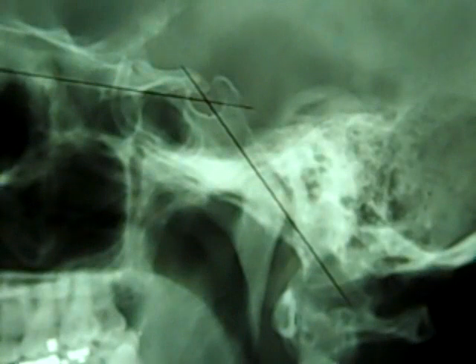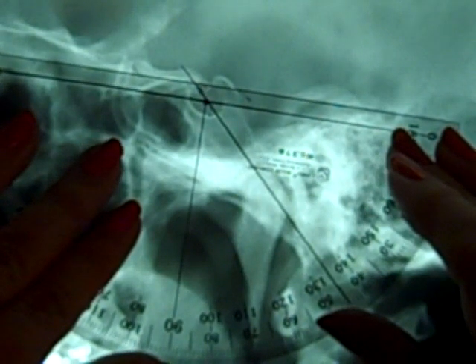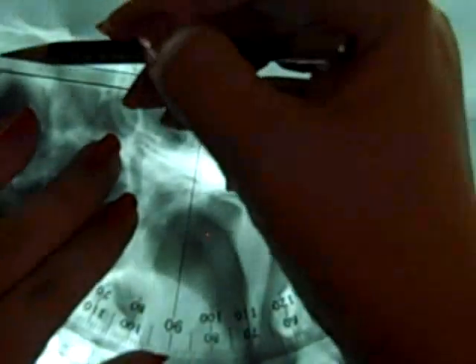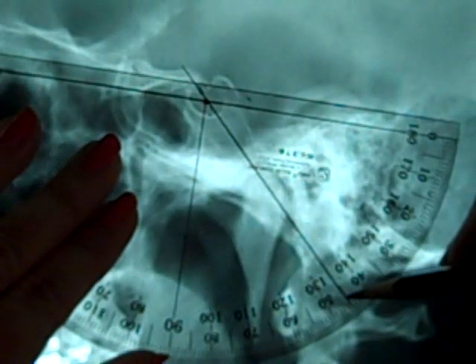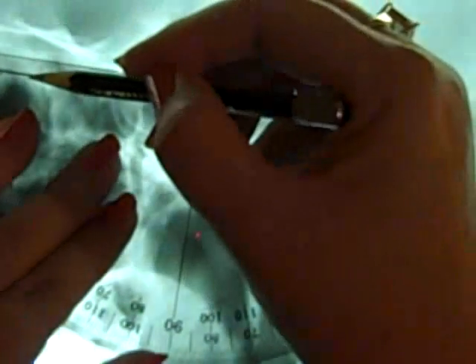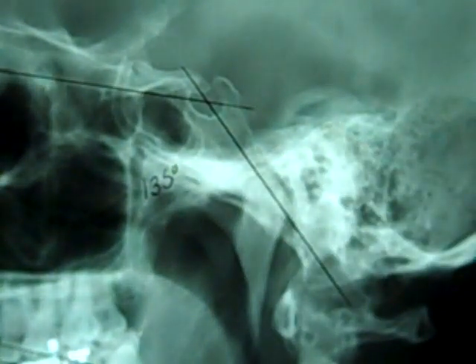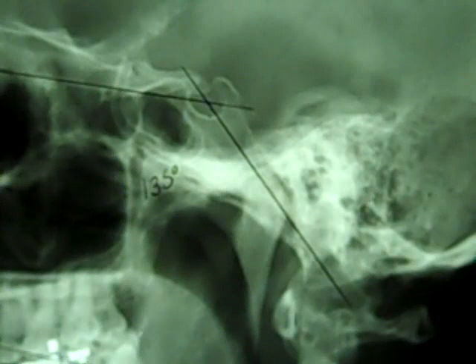To measure basilar angle, we're going to use our protractor. You put the base of the protractor over one of the lines, the hole of the protractor at the junction of the two lines, and we're measuring from here all the way across to here. This one measures about 135. Normal range is 123 to 152. If you had greater than 152, you might need to be concerned about platybasia and/or basilar impression.